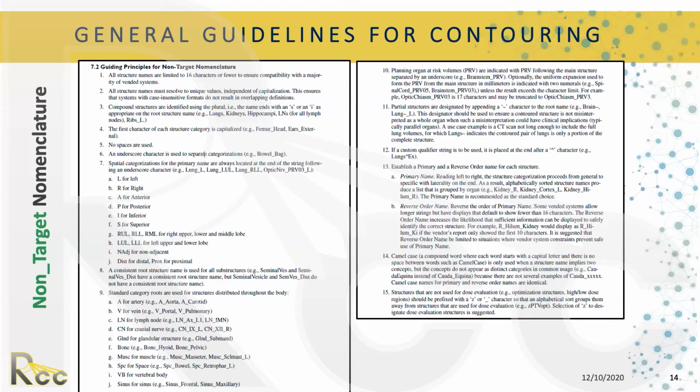So it's nice to have alphabetically all the OARs and targets that you're going to be evaluating, and then the structures that we as medical physicists create, which don't need to be evaluated on the DVH but which we use for optimization. They will show at the very end. So they're all going to be at the end, which is a nice thing, just to organize your structure sets.